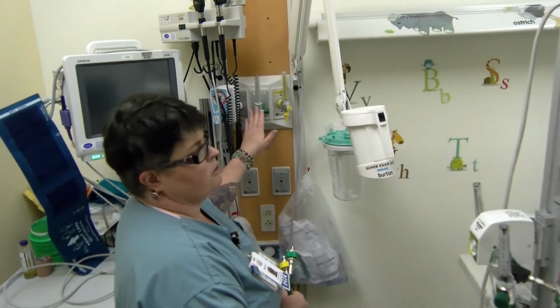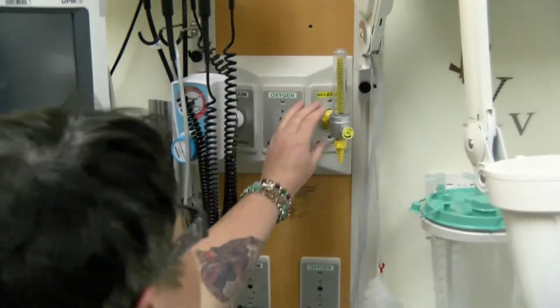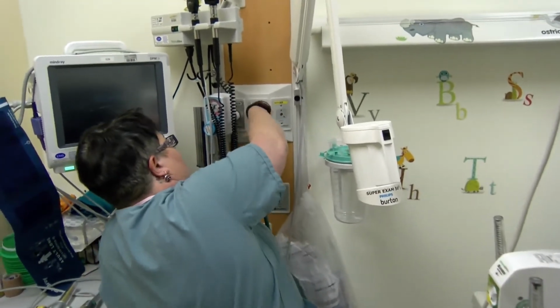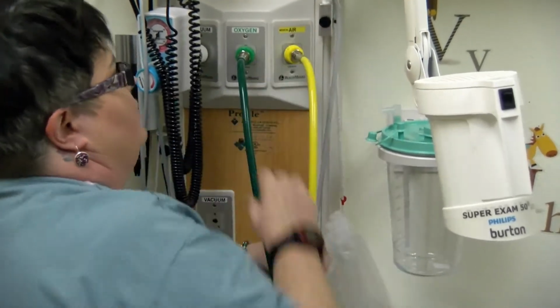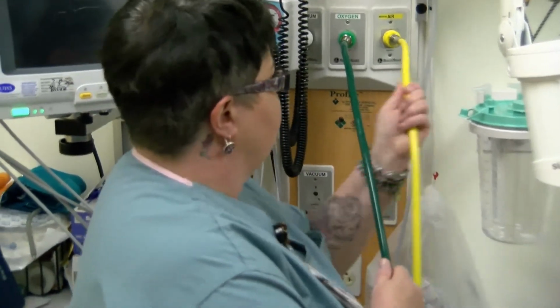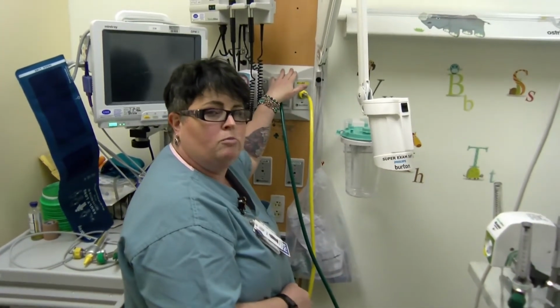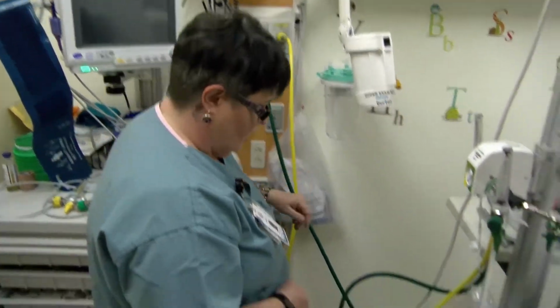You'll need to locate your oxygen and your air regulators on the wall. You'll just twist and pop each of these off. Keep in mind that you will put green in for oxygen, and then yellow is for your medical air. The machine will continue to alarm until both of them are plugged in. Once they are plugged in, it takes a little bit of force to pull them out once they are locked in. If at any time that alarm goes off after the delivery, you may have a failure in either your oxygen or your medical air, or it has become disconnected from the wall. So please make sure that you have it all plugged in.